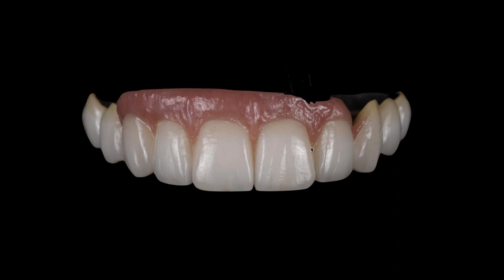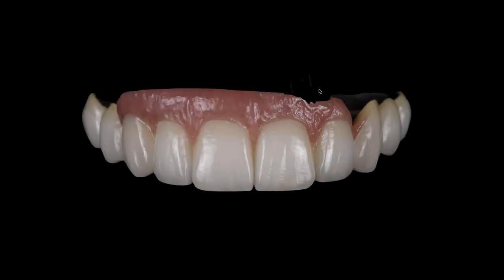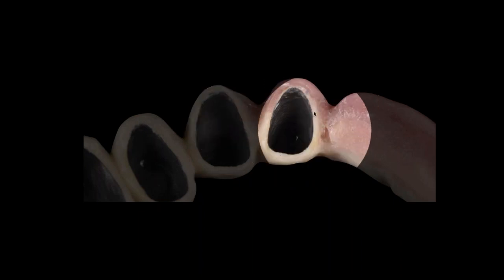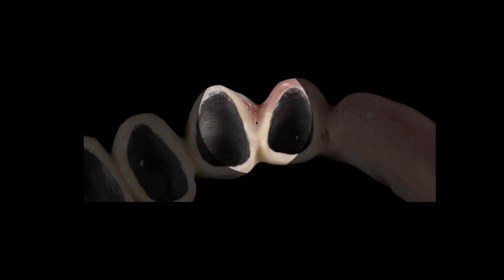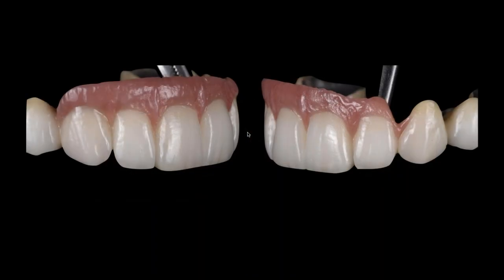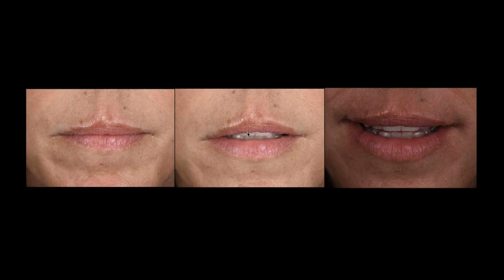And I can tell you that what wound up happening was I actually did ceramic margins, but when we touched the tissue on the number 10, we actually lost even more tissue. So I had to go back and fill that space. And I had to do that by adding ceramic margin material in pink, which I had to make because that doesn't really exist, to create a ceramic margin in pink, which was another whole major challenge in this case. So in the end, here's our final framework for Esty, and here's what she looked like at the end.